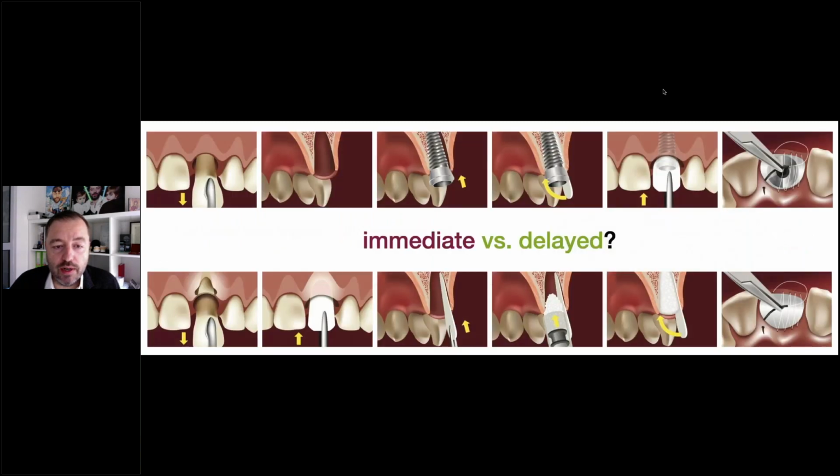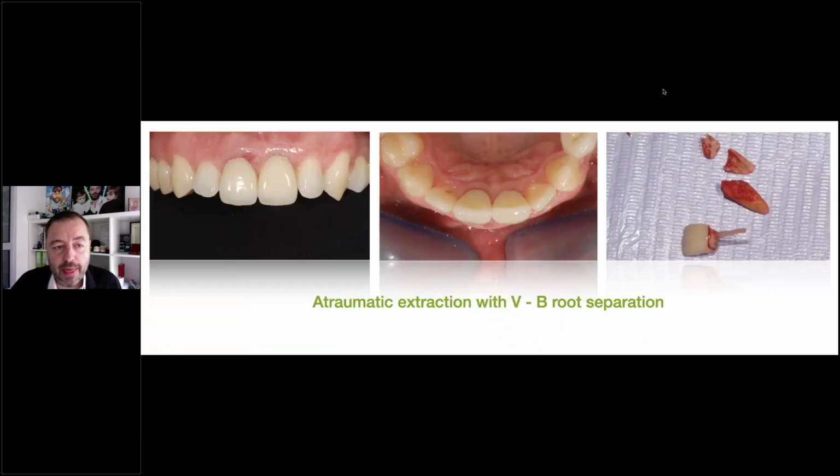So one more very important issue with everyday implant placement: shall we do it immediate or shall we do it delayed? With the analog way of thinking, we had a lot of problems restoring immediately, taking impressions and things like that. Now with the digital protocols, we have a very, very simple way to get this done.